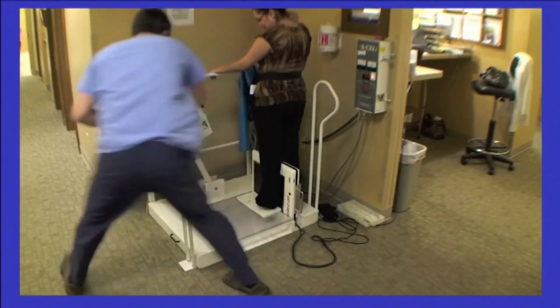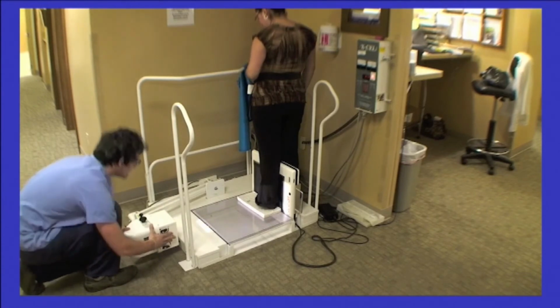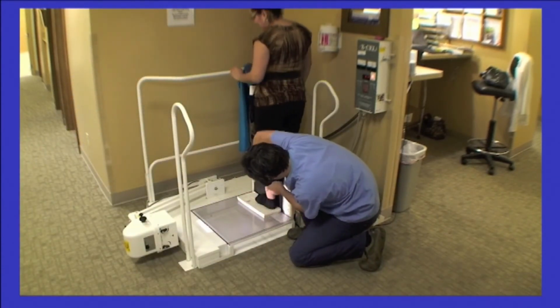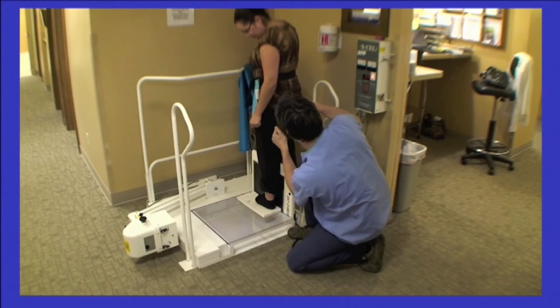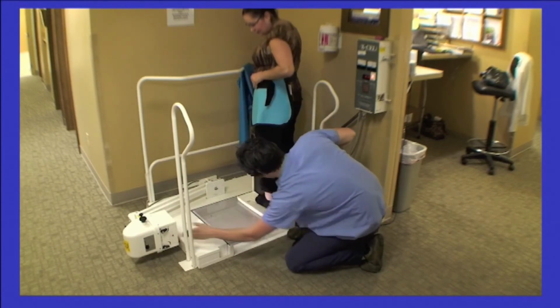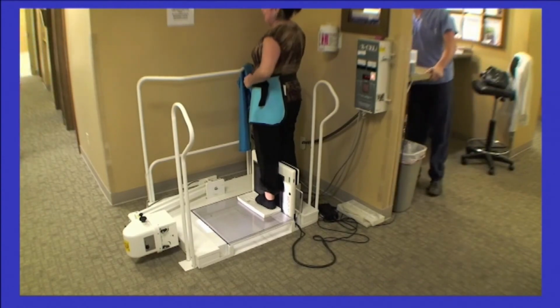When this is in place, you will make sure the head is tilted to 0 and then dropped completely to the left side and down as a normal lateral view is shot. Make sure the beam completely illuminates the cassette and the black circle is on the middle of the foot. You will then position the patient as before mentioned so you can gain access to their lateral foot.